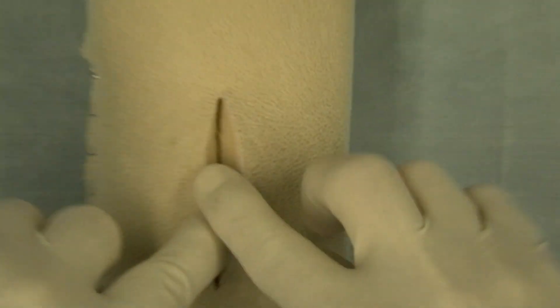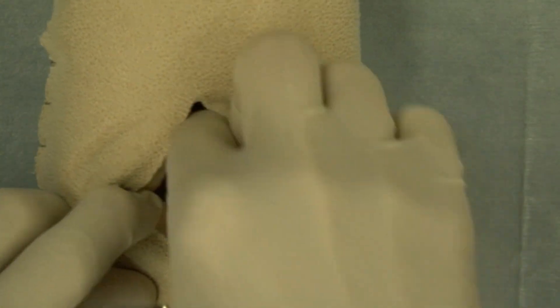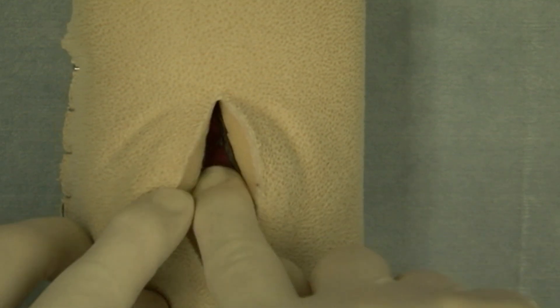Just to review, this is the skin portion of the daisy and of course inside the daisy is the intestinal portion which will leave tucked inside.